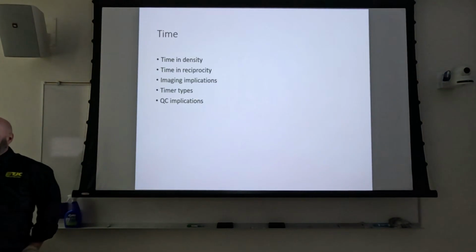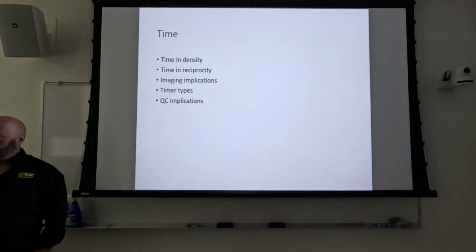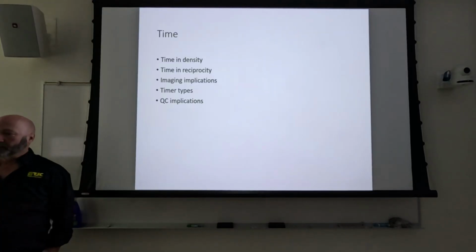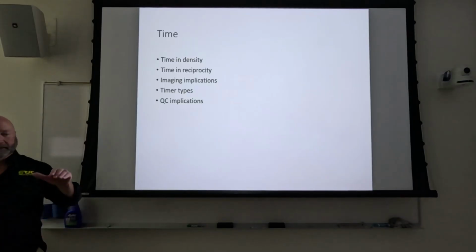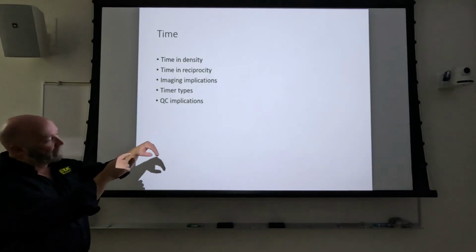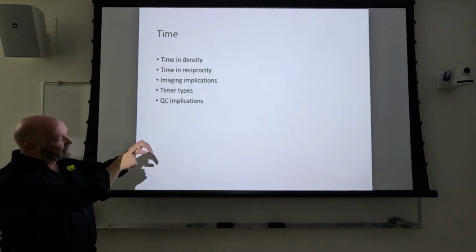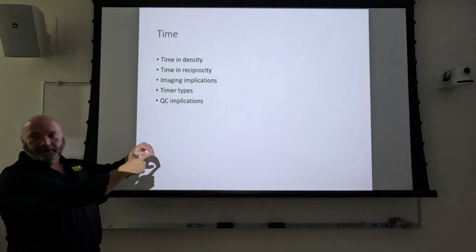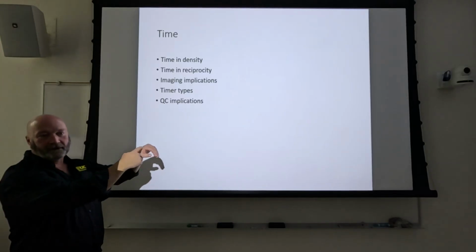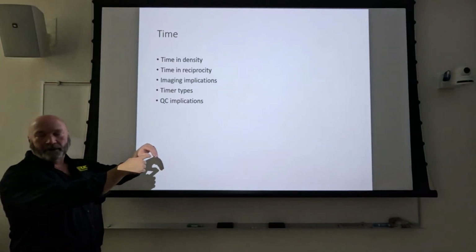So when we make an exposure, there's two words. You push the button to make the exposure, and they call that interrogation time. It's the time difference between when you mash the button and the exposure actually starts. So going back to the single phase and the synchronous timers, if your pulse is here and you start your exposure here, but the little generator in there doesn't let you begin the exposure till over here, then there's going to be a very, very short pause.